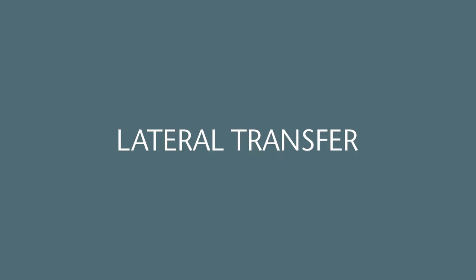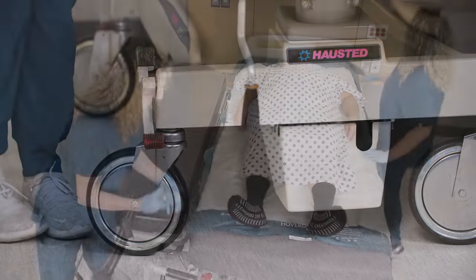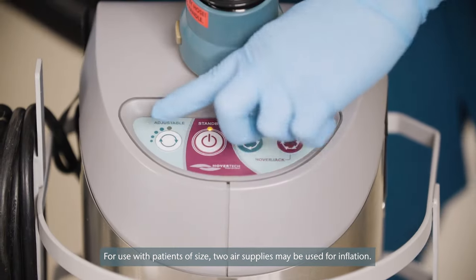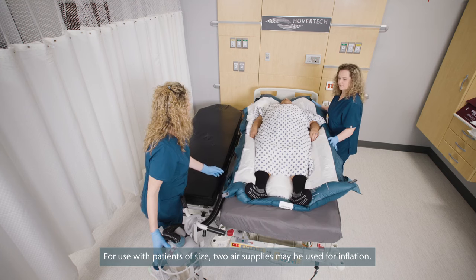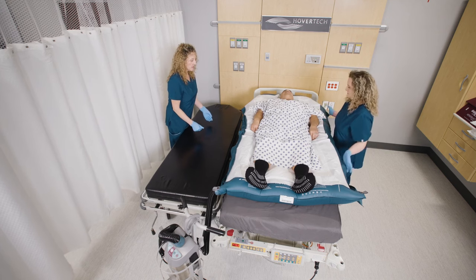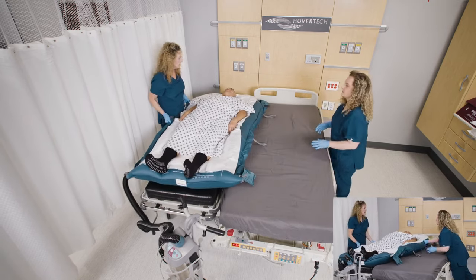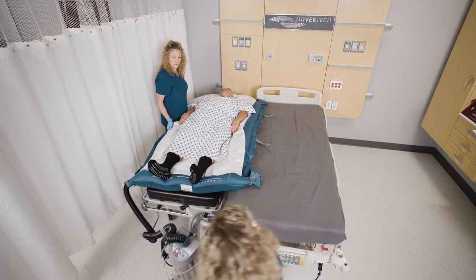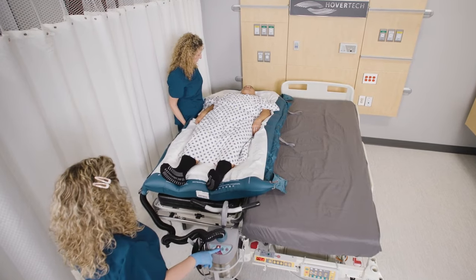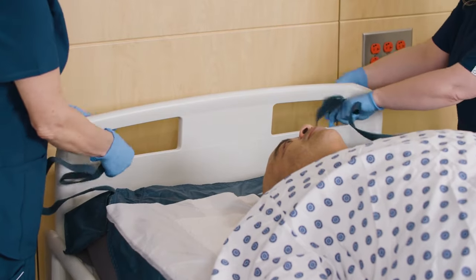Lateral transfer. Ensure the transfer surfaces are as close as possible and lock all wheels. If possible, transfer from a higher surface to a lower surface. Insert the hose into the air intake valve and snap into place. Press the variable speed button to ensure the patient is centered. When confirmed, press the 39-inch hover mat setting on the air supply. Push the Pro's AIR at an angle, either head-first or feet-first. Once halfway across, the opposite caregiver should grasp the closest handles and pull to the desired location. Ensure the patient is centered on the receiving equipment prior to deflation. Turn off the air supply and employ the bed or stretcher rails. If transferring back to bed, remove connecting straps from pockets and loosely attach to solid points on the bed.